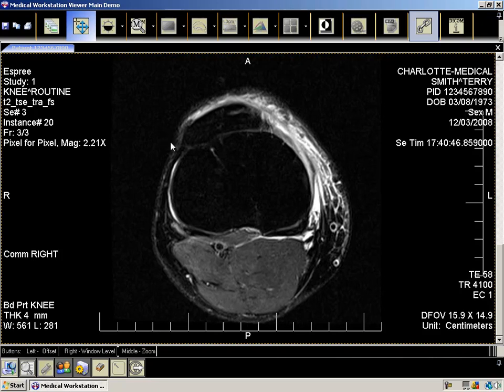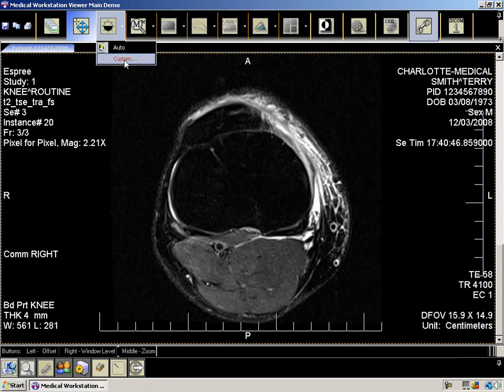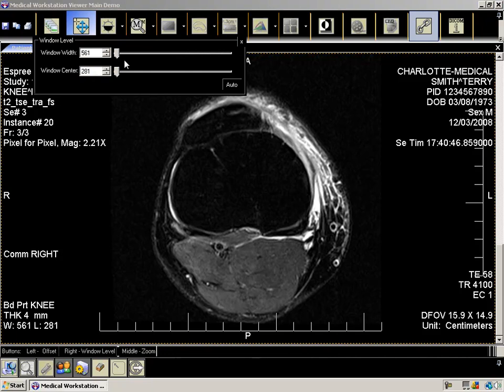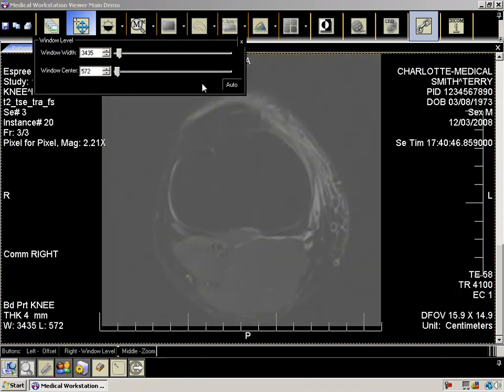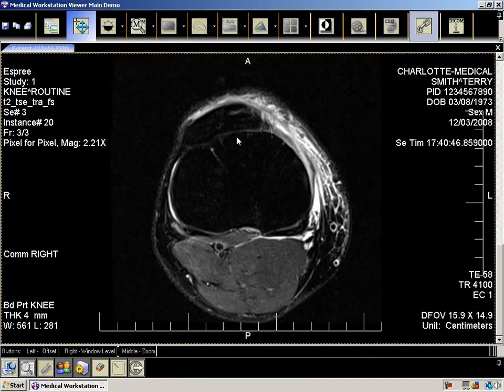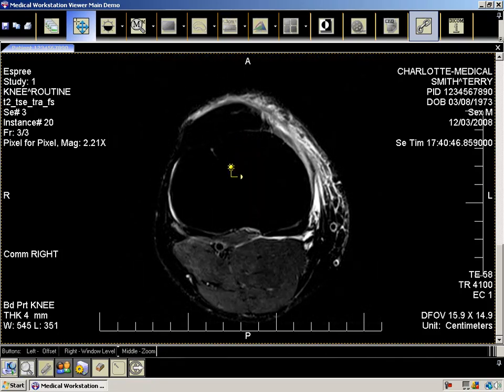The next feature is the window level. This allows you to change the range of gray values displayed at one time. Left-click on the button to show the drop-down. Here you can either have the workstation automatically level the image based on the stored dataset values, or you can modify the values yourself using the custom option. For quick fine-tuning, hold the right mouse button down and move the mouse left to right or up and down. This feature is always on and available with the right mouse button.